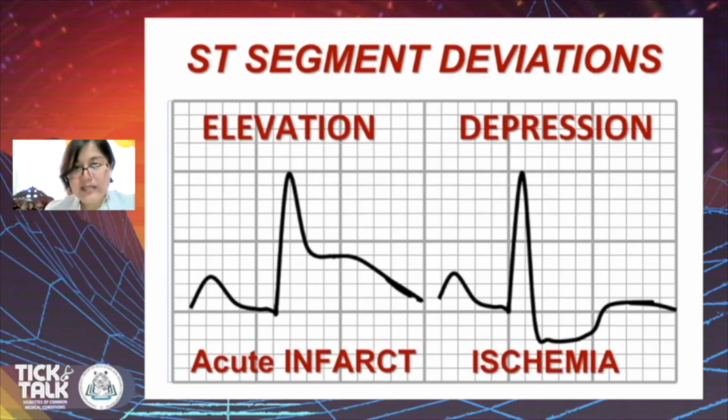Again, we will have to remember that if we talk about infarction, myocardial ischemia, it is not only the characteristic of the ST segment, even the T waves are important. We will have to take note that these are seen in contiguous leads, meaning leads that represent a particular wall or portion of the heart. So, basic elements of your electrocardiogram.